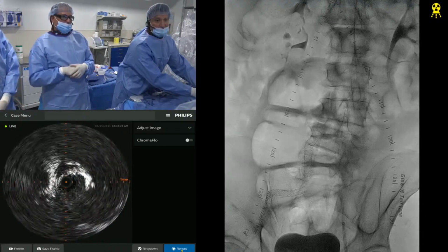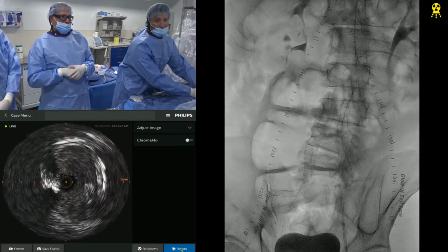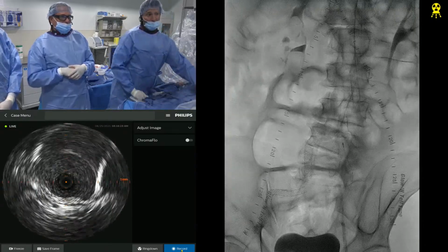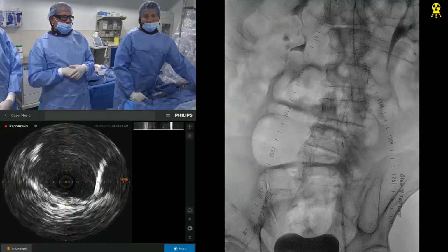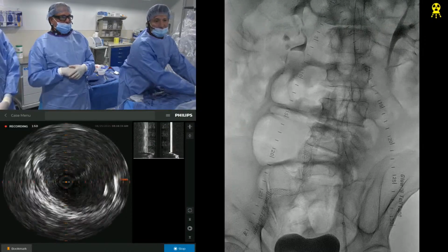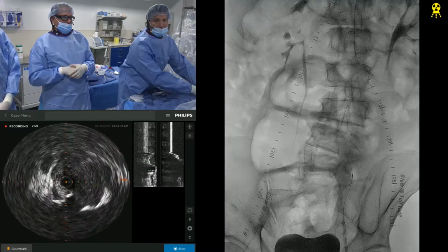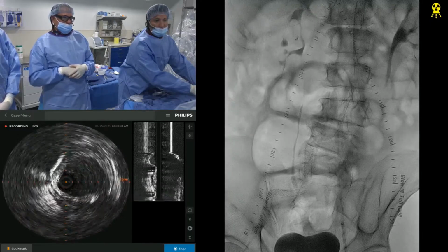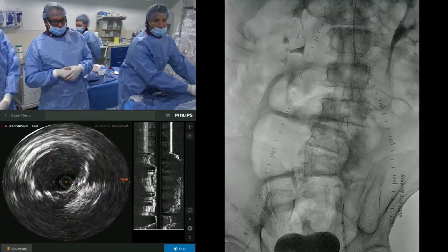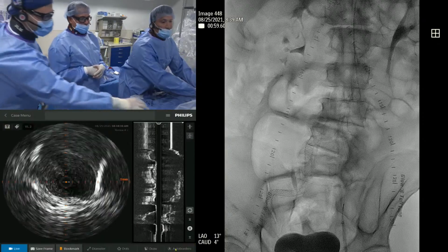Here and all, it's fine. It's very calcified. There it is. That's one of the landing zones you have. But you can see here, you have another lesion, so you have to end it right here. And then this is a bigger area. That's about 10. Let's keep going. I think we have to figure out what we want to do. I just want to see what's happening after the aneurysmal segment, which is just calcified but non-obstructive iliac. So we just have to deal with the ostium, which is good. Walk it back. Now the question is, how are we going to deal with this?